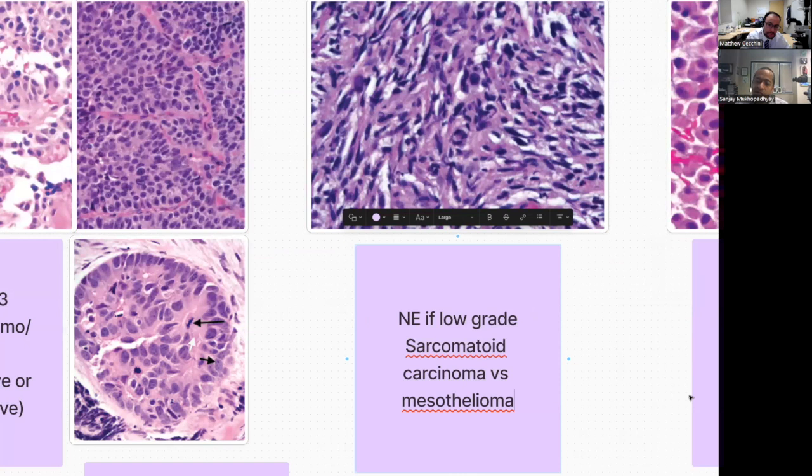So I think if it's keratin positive, your differential is between two things. And in those two, I feel that where the mass is located is the most important thing. Now, if keratins are negative, then you have to think of sarcoma. And what I do is show it to our sarcoma people, but don't do a vimentin. That is not your friend here. What do you think, Matt? What's your approach? I'm really curious to hear how you approach this.